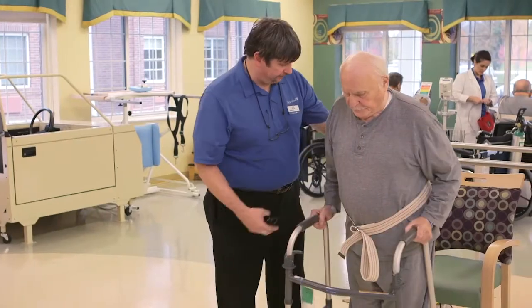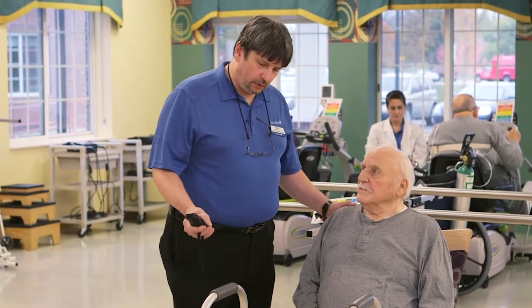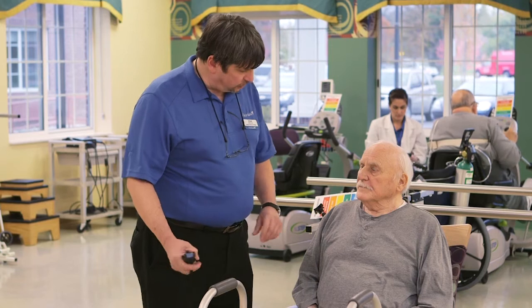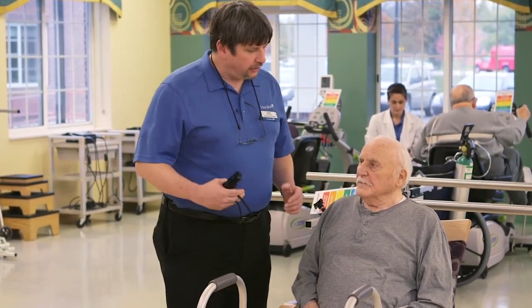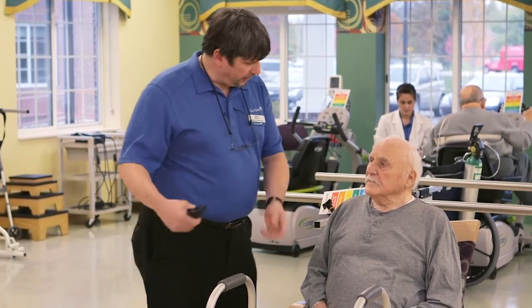Let's take a couple of steps back and have a seat. Doing this exercise was really good for you because you were up for 76 seconds and you were able to do the weight shifting going from side to side without hanging onto the walker. You didn't have any pain in your hips or your knees. You got a little bit of core strengthening, so that's going to make it easier when you're doing activities at home, like maybe working on the dishes or even stepping in and out of the bathtub or the shower.